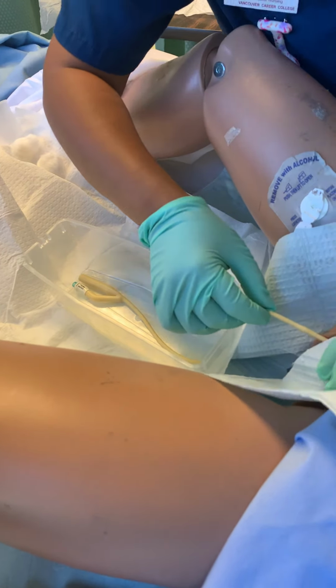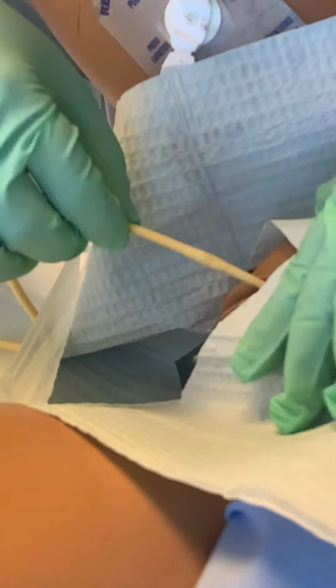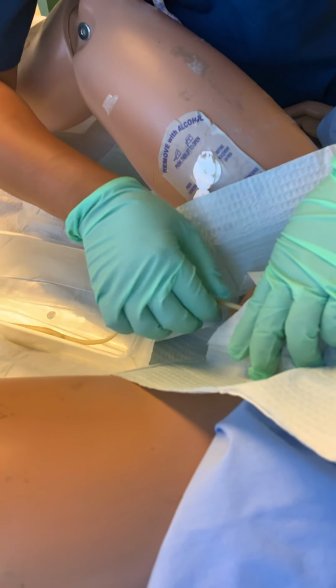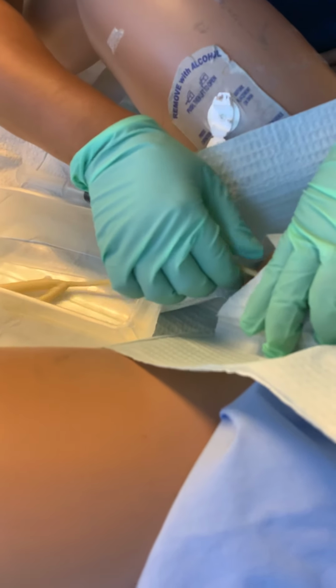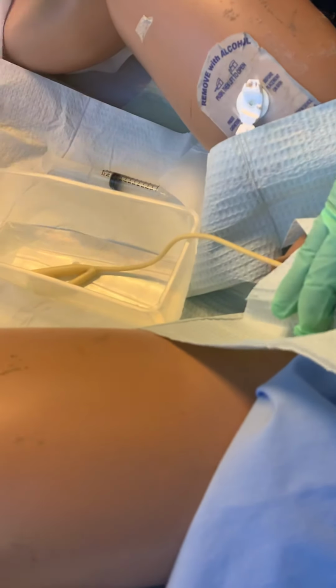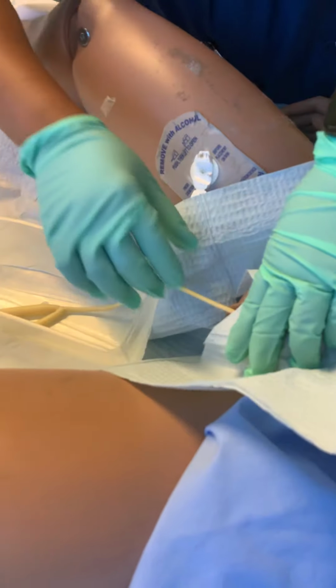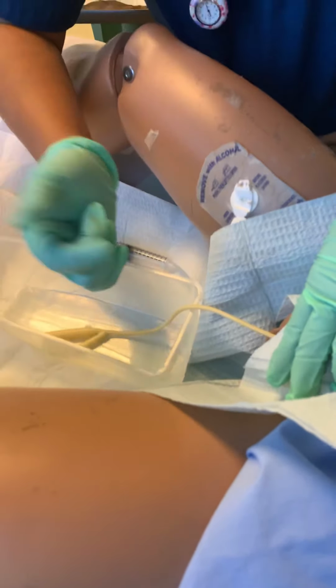Now, Mrs. Smith, I have to put it in, okay? It's going to be a little bit uncomfortable, but it's going to be okay. All right. So make sure the hole is not too big, because this is for the cesarean. So what if you put it in the wrong hole? Well, leave it there. You don't need to touch it anyway. And then you don't have a catheter anymore, so what are you going to do? You ask your buddy to get another one.